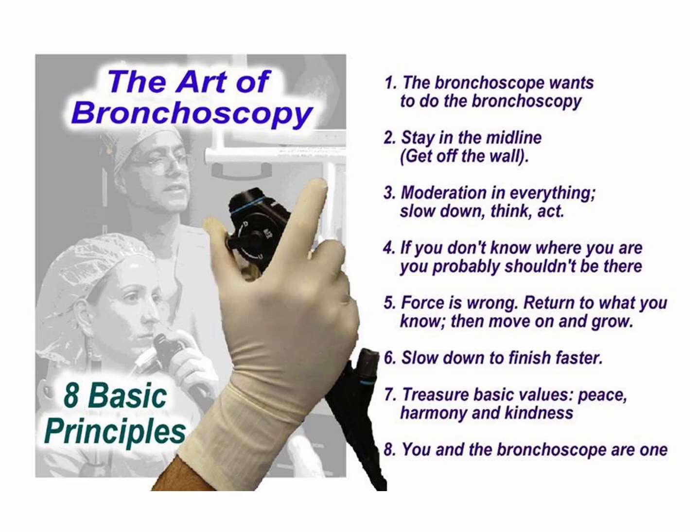Conventional TBNA is a technically elegant procedure that combines anatomical knowledge, careful planning, and disciplined execution. Success depends upon selecting the appropriate needle insertion technique, understanding mediastinal anatomy, coordinating effectively with assistants and cytopathology personnel, and obtaining representative specimens while minimizing unnecessary trauma.